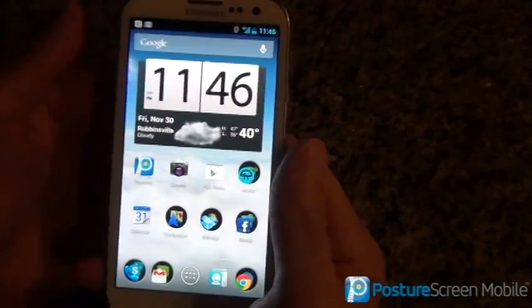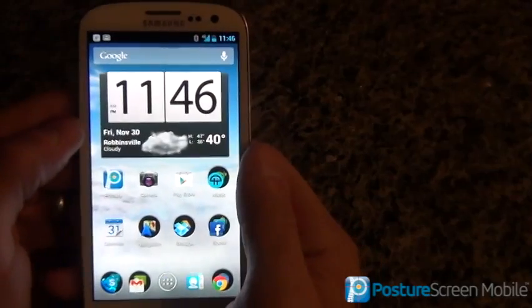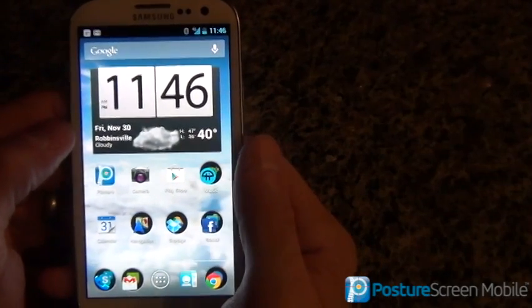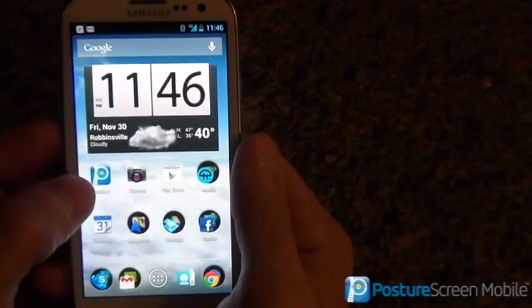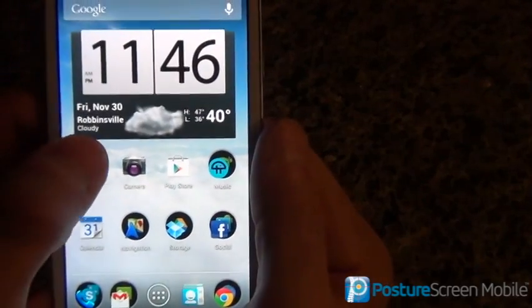Let's begin. I'm on a Samsung Galaxy S3, and we're using Posture Screen Mobile. Here's the icon for Posture Screen Mobile.